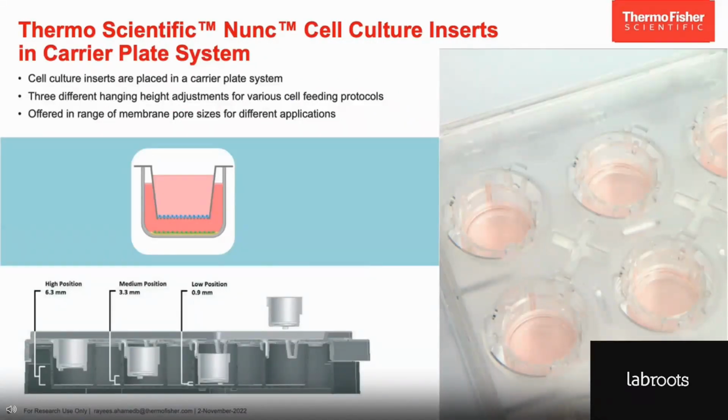So in the real world, how do cell culture inserts look? What you see here are Nunc cell culture inserts in a carrier plate system developed by Thermo Fisher Scientific. It is a two compartment multi-plate system consisting of cell culture inserts with a porous membrane, a carrier plate and a regular cell culture plate at the bottom.